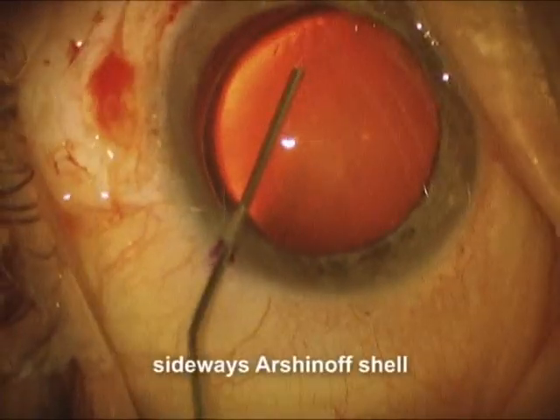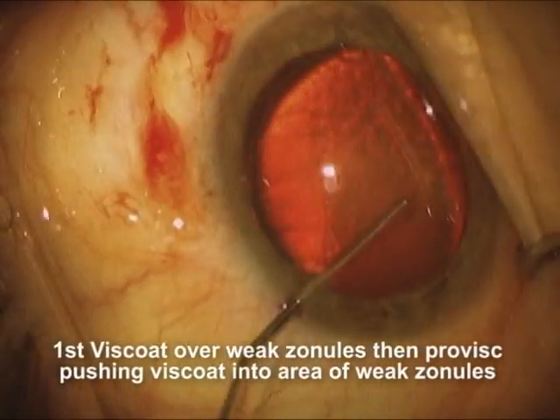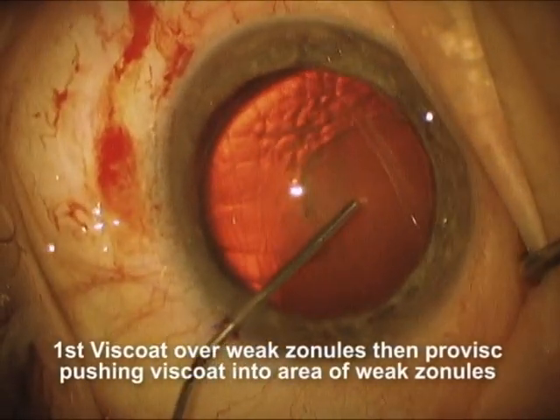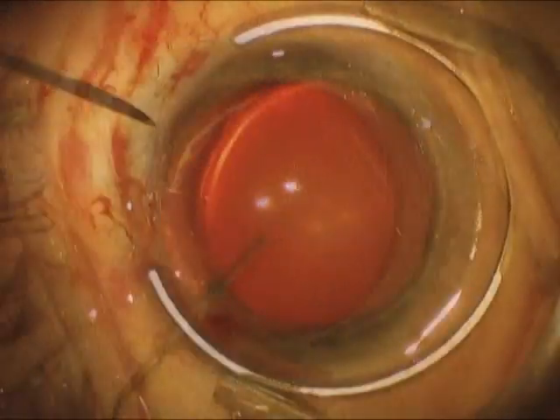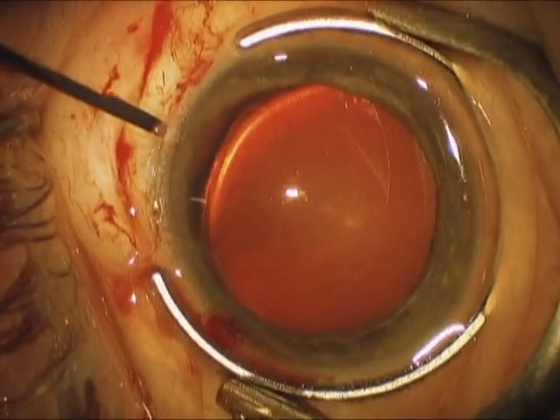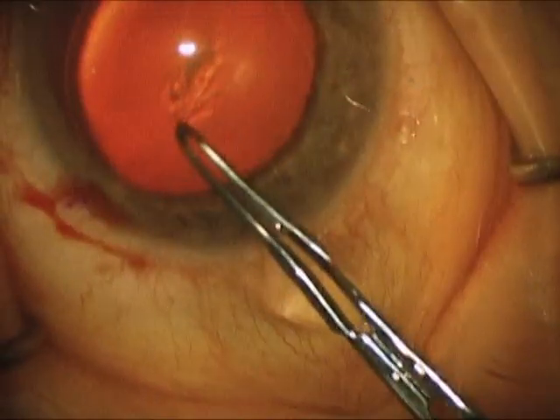You can see that the lens had been prolapsed a bit inferiorly. Here we're going to use a sideways Arshinoff shell where we place some Viscoat in the area of the loose zonules, then place Provisc in the other area and squeeze over the Viscoat into the area with the missing zonules. We're going to prepare for the use of an iris hook for the capsular tension segment.